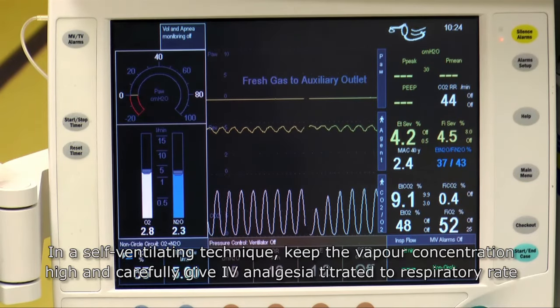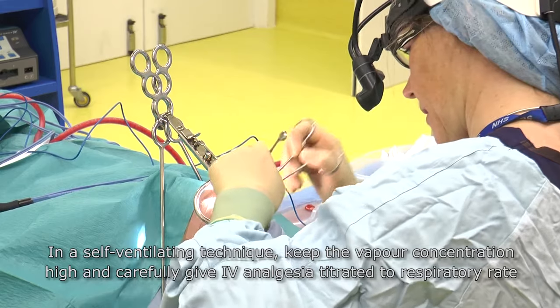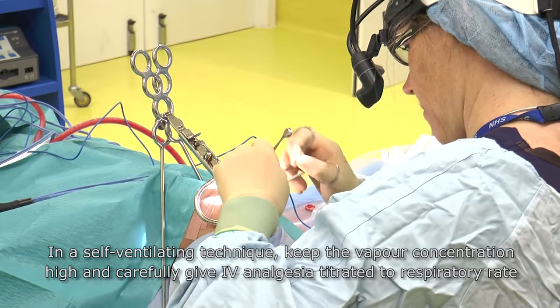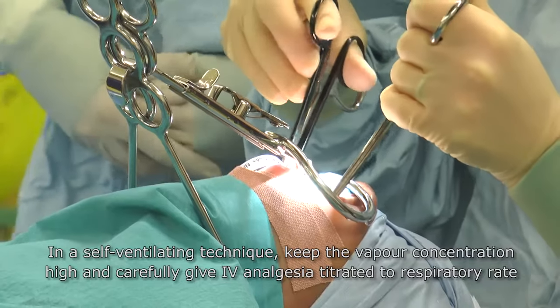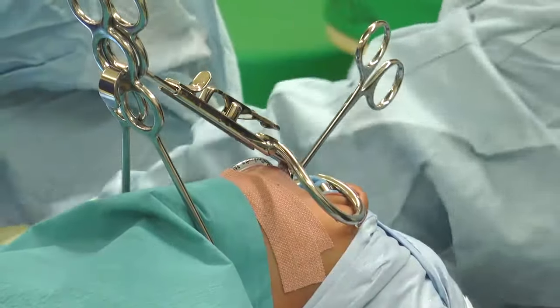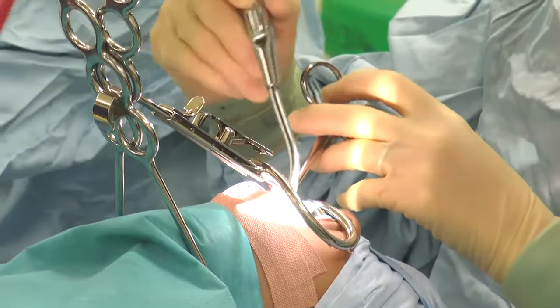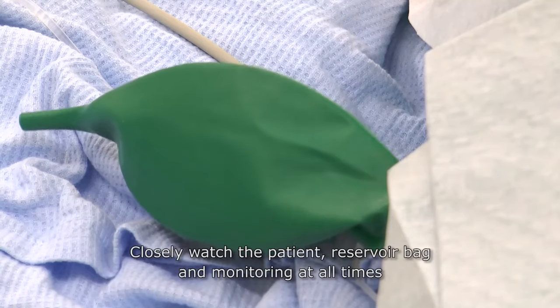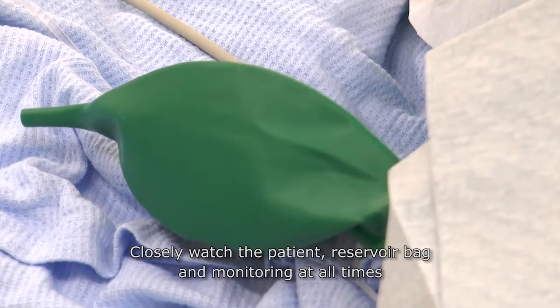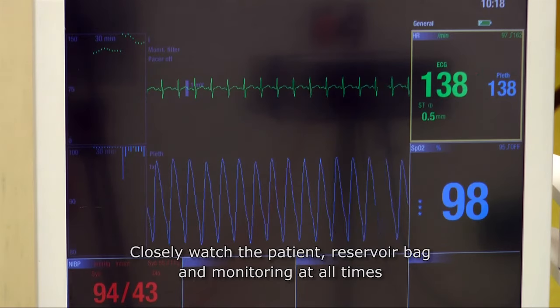In a self-ventilating technique, keep the vapour concentration high and carefully give IV analgesia titrated to respiration. Closely watch the patient, reservoir bag and monitoring at all times.